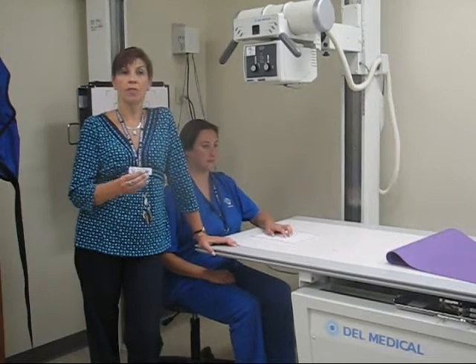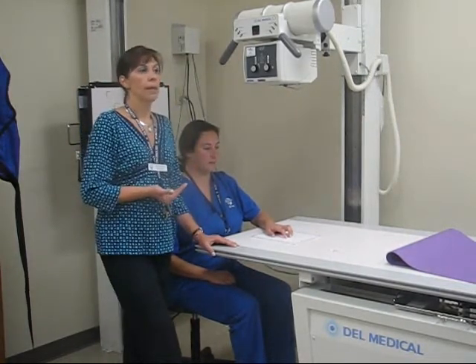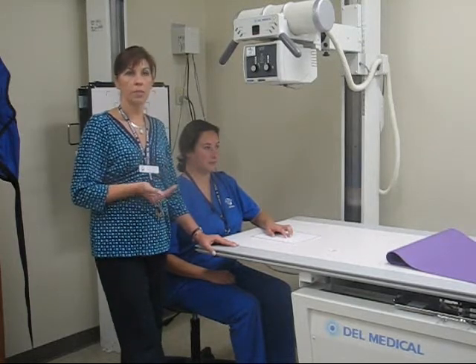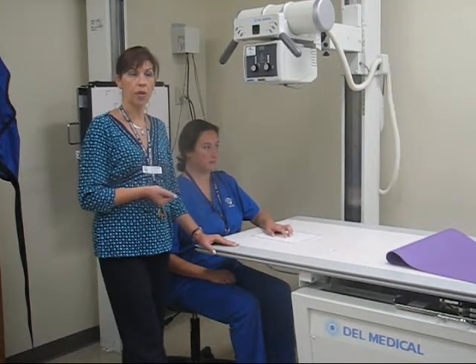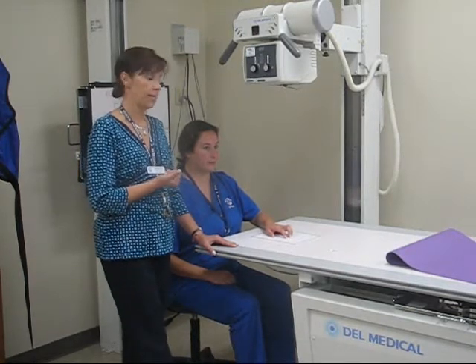So you're going to have to follow the protocol of the place where you work. In case your doctor wants solely the finger in question, you're going to have to include the entire finger and the metacarpal to which it is attached, at least.